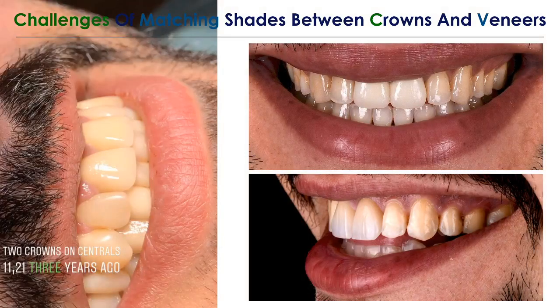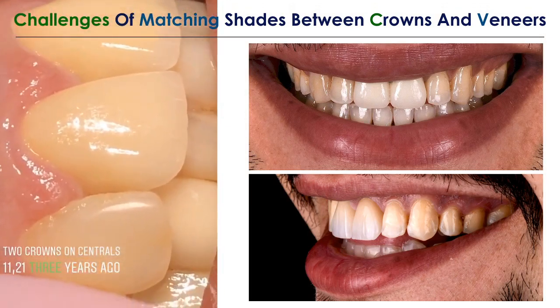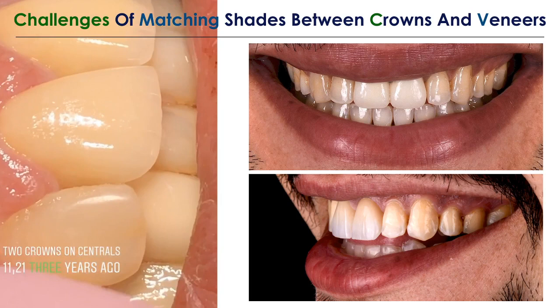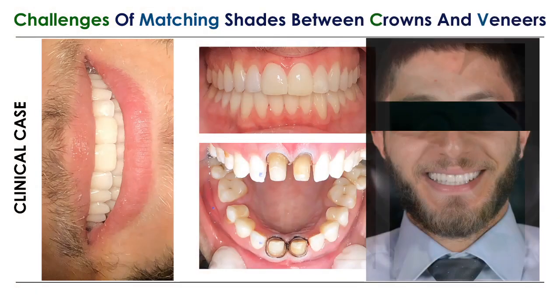Okay, and this is my patient, also for 2 centrals. It's very important to do mapping, shade mapping for the restorations. You have to send to the dental lab the cervical color, the body color, and the incisal color of your restoration before sending, because you have to make it like the natural dentition. This is also for 2 centrals. You can see, and this is after.